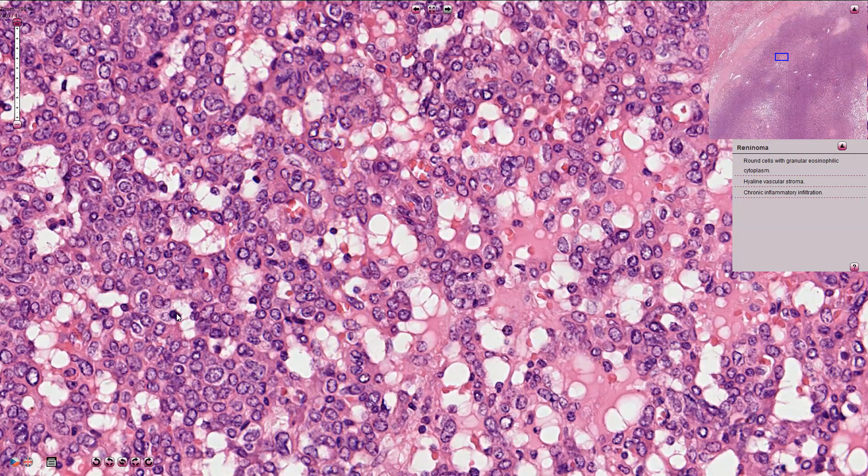On immunohistochemistry, the tumor is often positive for renin, vimentin, CD34, and also CD117.